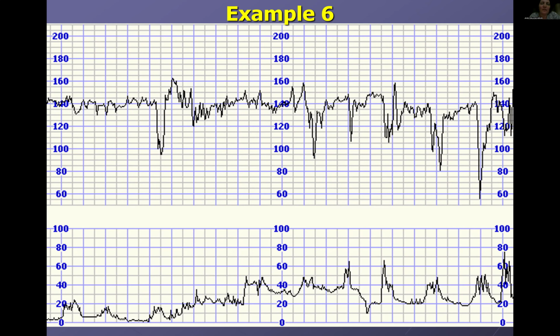But again, you see that in the overall picture. If the variability has remained fine, or maybe the patient, let's say, was given analgesia in the meantime, maybe that's why the baseline went down a bit. You see it in the overall. And when I said in the beginning that at least every hour, even if it's a CTG, every hour you assess.